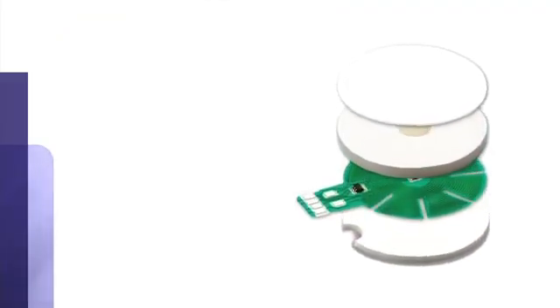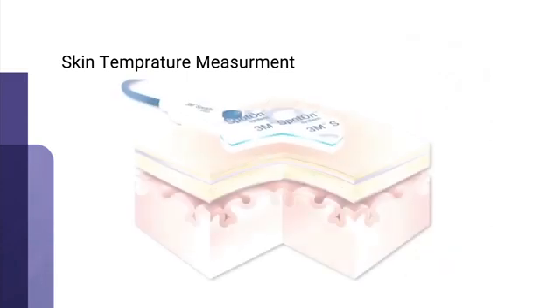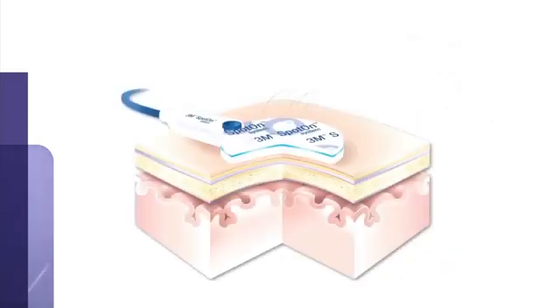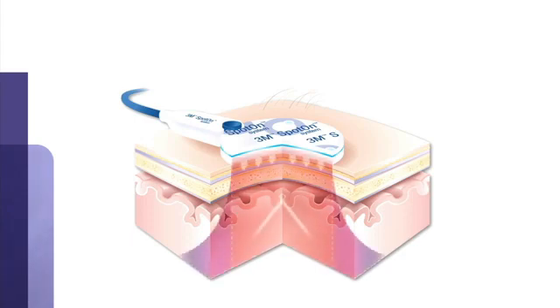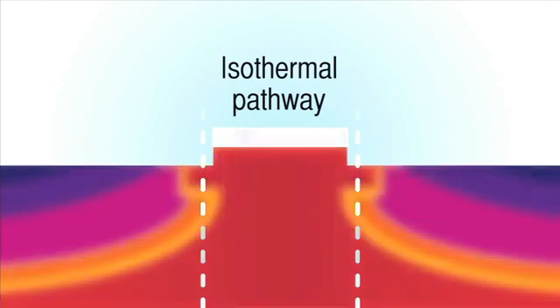The transducer normally used for temperature measurement in a patient monitoring system is a thermistor. Changes in resistance of the thermistor with changes in temperature are measured in a bridge circuit and indicated on a calibrated meter. The measuring range is 30 to 42 degrees Celsius. In a patient monitoring system, provision for 2-channel temperature measurements is usually made. The temperature probes are skin, rectal, esophagus, and delta temperature measurements.